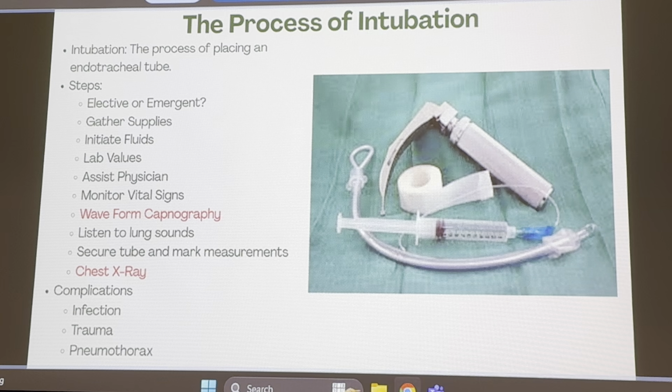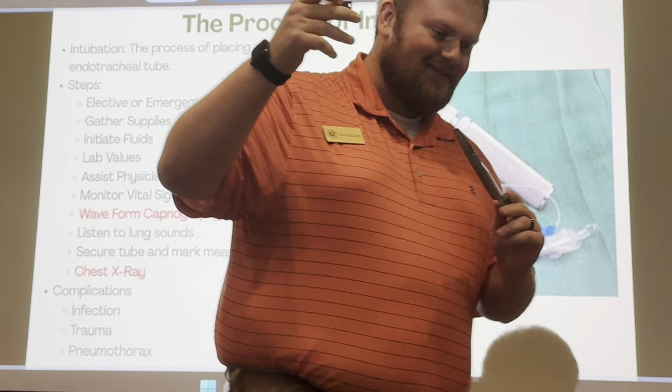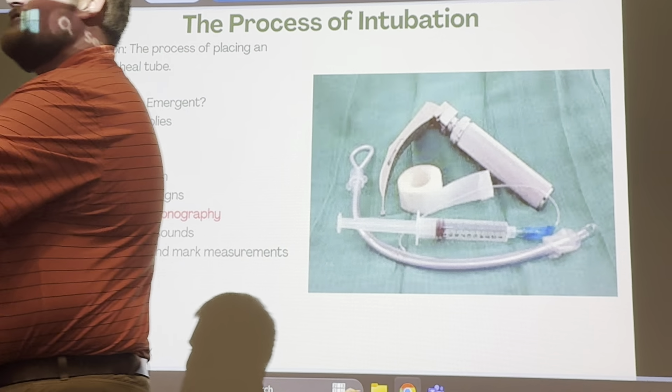Miller straight, you sure? Yes. Good. All right, Miller is straight. So see the difference? I know this one's really huge too, but this one's pretty straight, right? Okay. It's like an animal. I know this one's big. I've never seen one this big, but that's, like I said, this is what I had available. And this one's more curved, right? So you can see the difference.